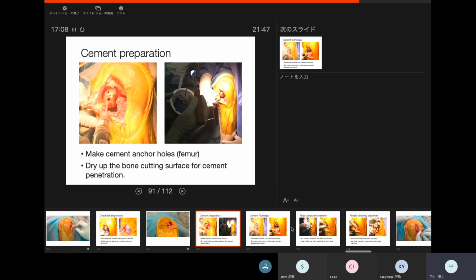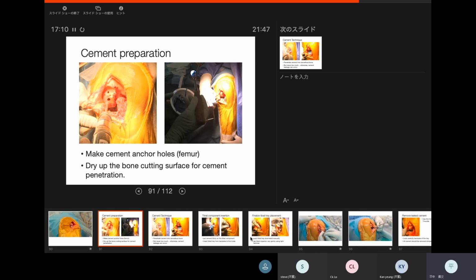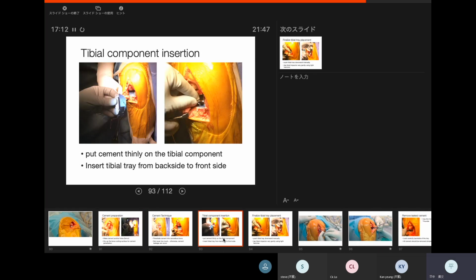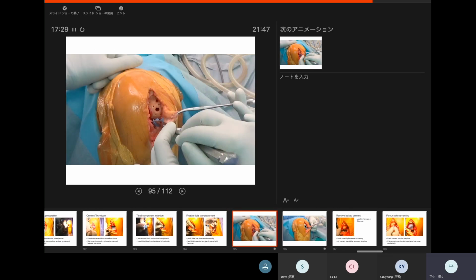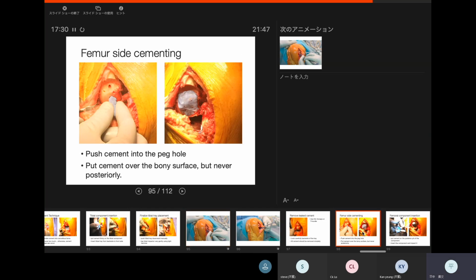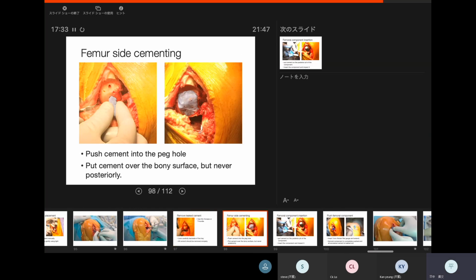And the cement preparation, make the cement anchor holes. Let's start from the tibia side and push the cement into the cancellous bone to improve cement penetration. That can prevent the loosening and the lateral lucency. And then insert the cement into the peg hole for the femoral side.